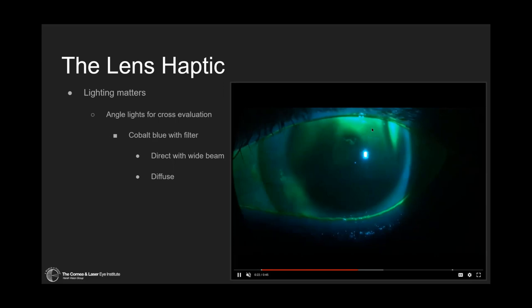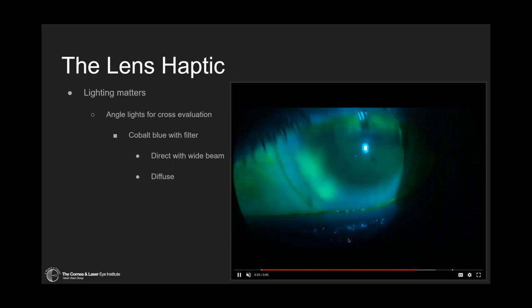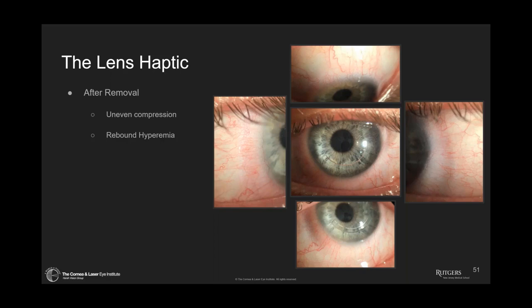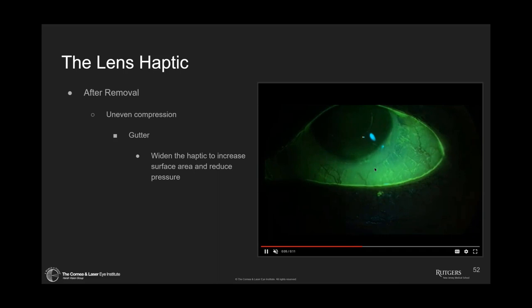If we have this fluorescein ingress, what's going to happen? We're going to have a case where debris builds up underneath the lens, causing midday fogging and other problems. How do I solve that? I fit the lens better — I make that lens align better. We can also look after lens removal — this will help us judge what to do with the haptic because you can see the areas of compression and areas of hyperemia very well. We can also put fluorescein on the eye and watch for a gutter — you can see that fluorescein just falling down the gutter. That's what we want to look at.